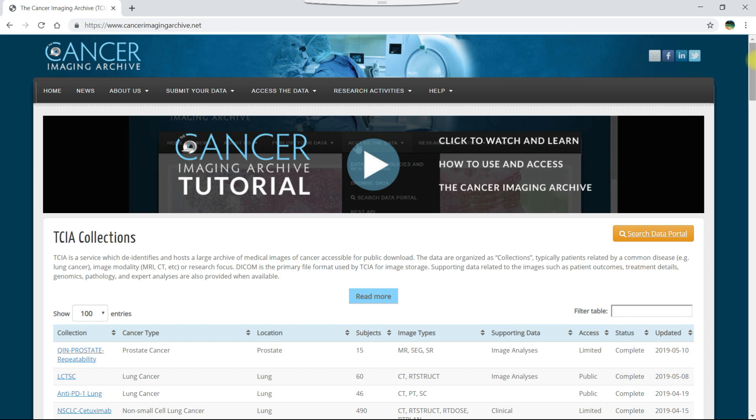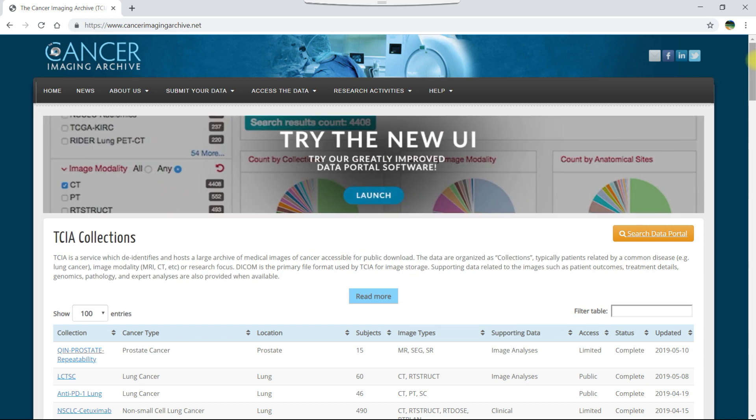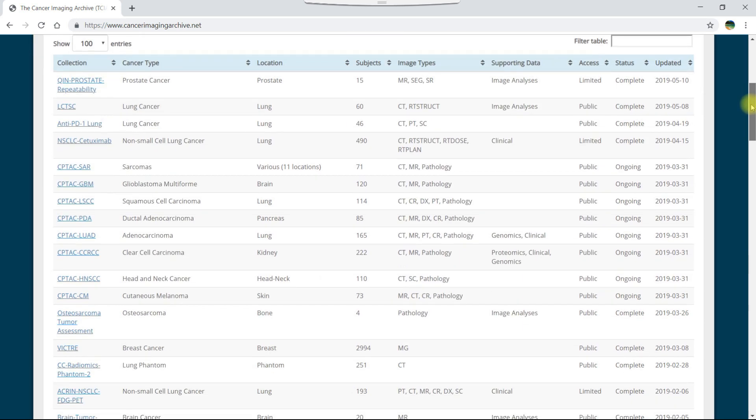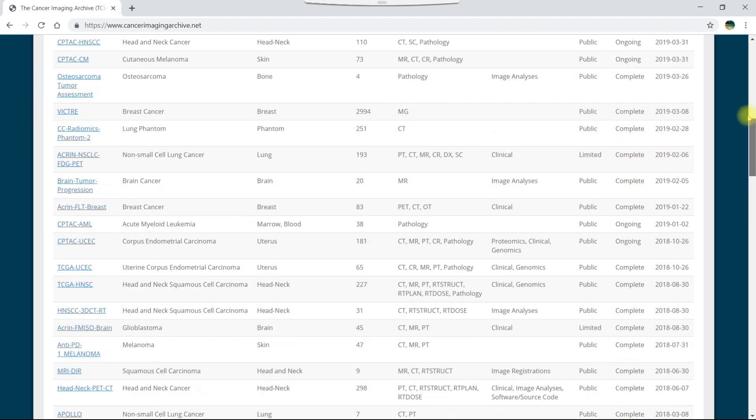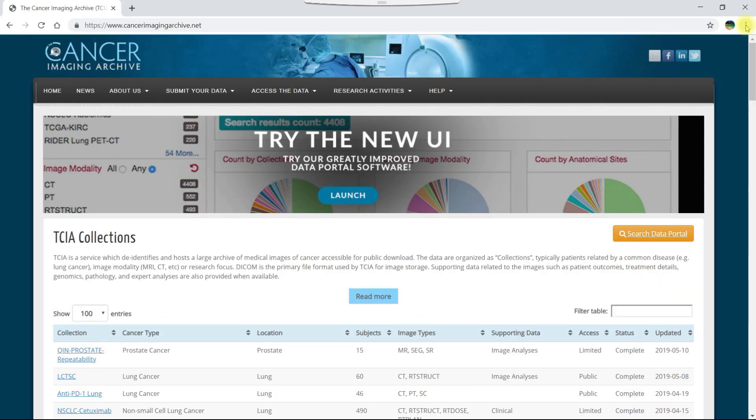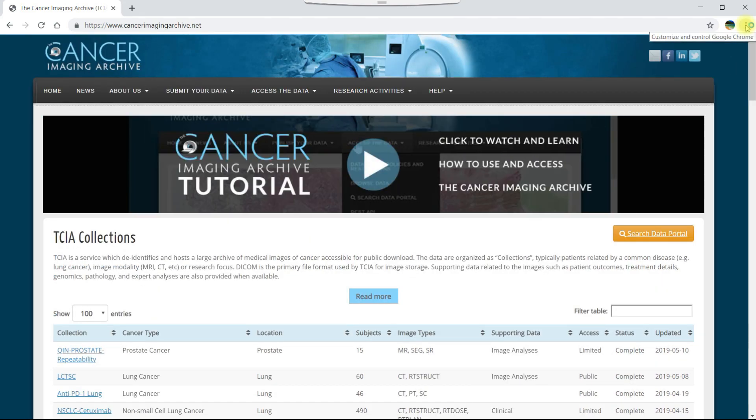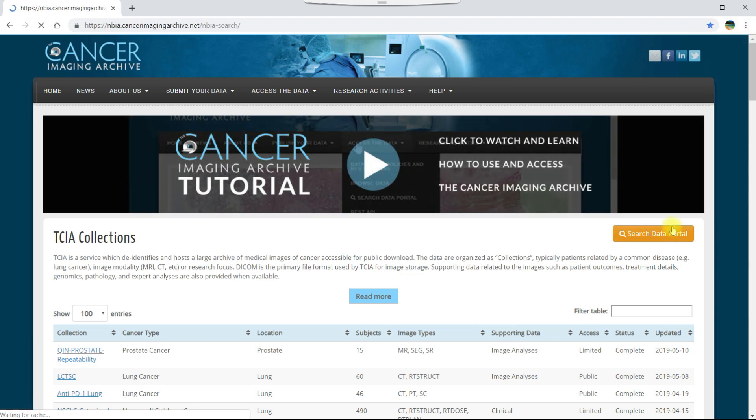TCIA has many collections that you can download right here on the TCIA homepage, but if you are downloading multiple collections or need to search for specific data, it's easier to use the data portal, which we can start by clicking the search data portal button.